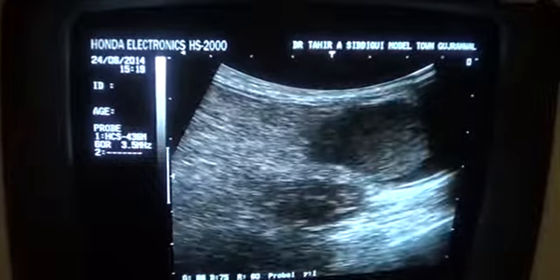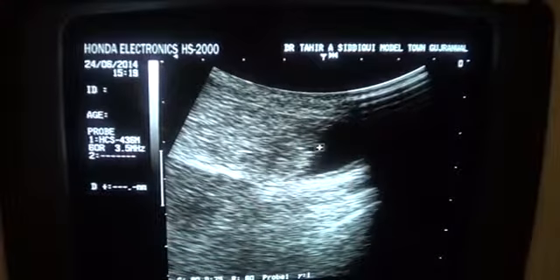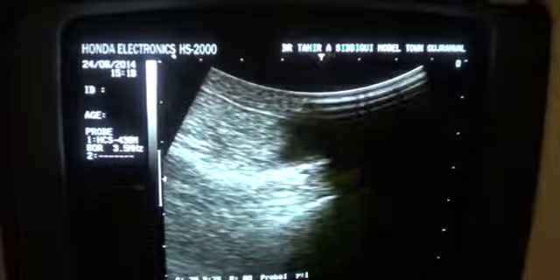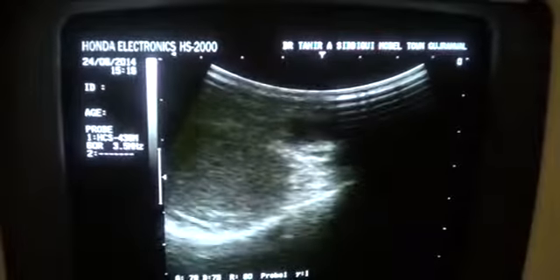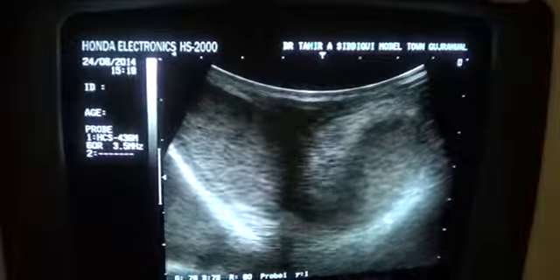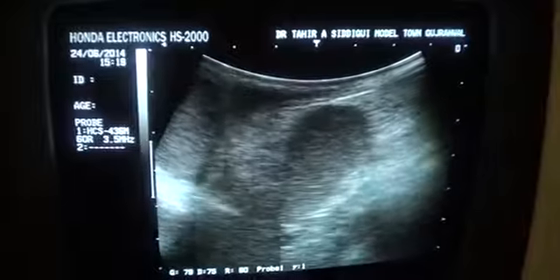We can also see a small amount of fluid in the left hemiscrotum. This is the fluid, and this is the left testis. The echogenicity is normal, and there is a small amount of fluid seen in the left hemiscrotum. This is the omentum herniating into the left hemiscrotum. This fluid is of no significance.